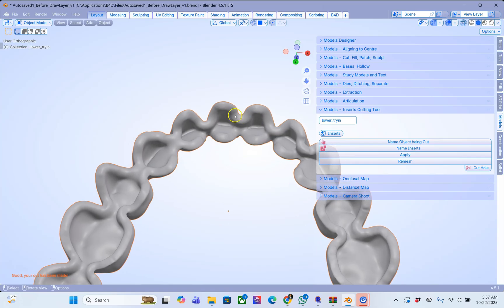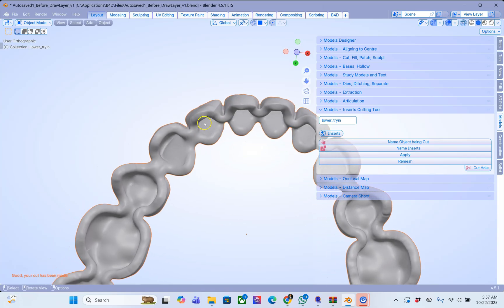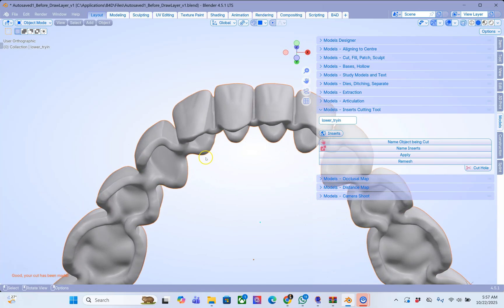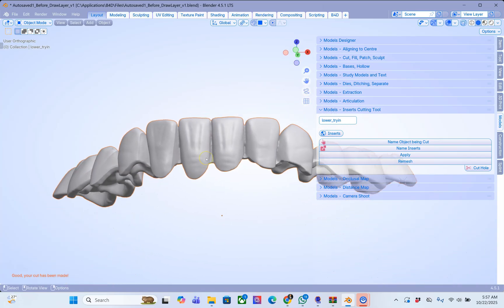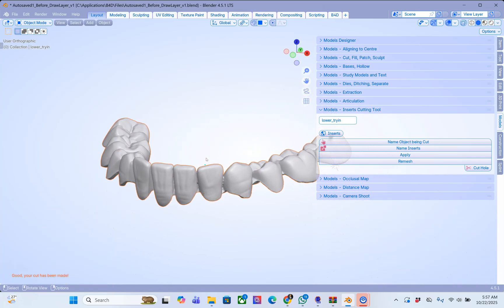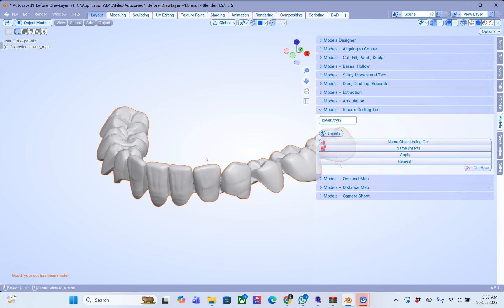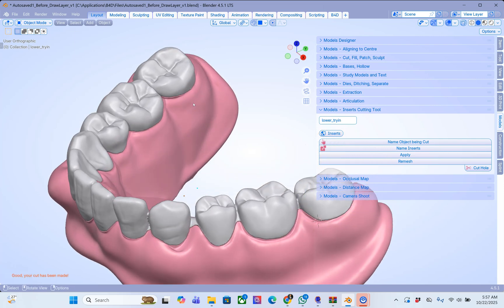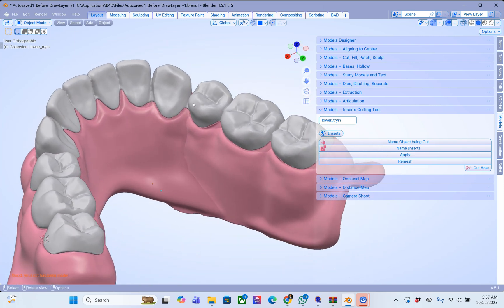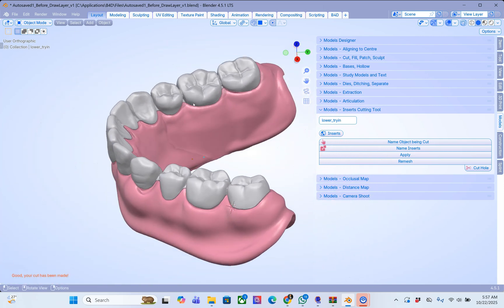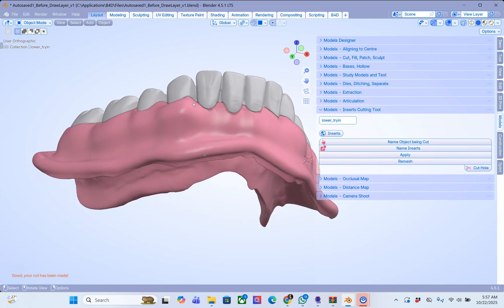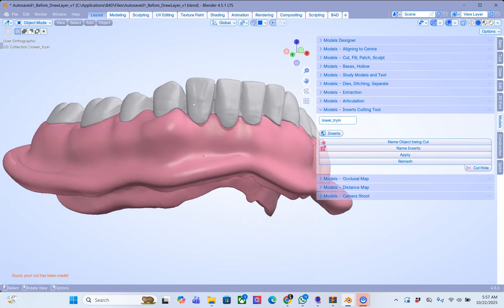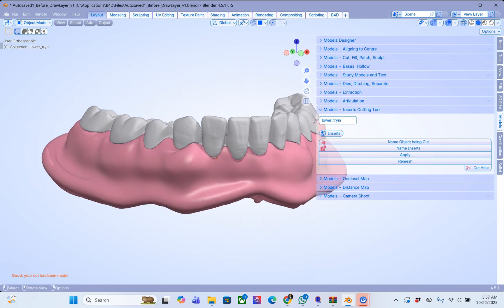Of course we could have maybe smoothed it a little bit more inside to avoid any undercuts, but this is the workflow. Hope you enjoyed this video and have a good day. Bye.